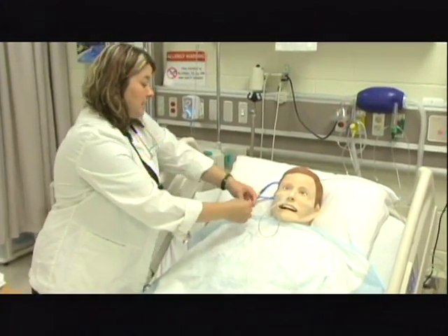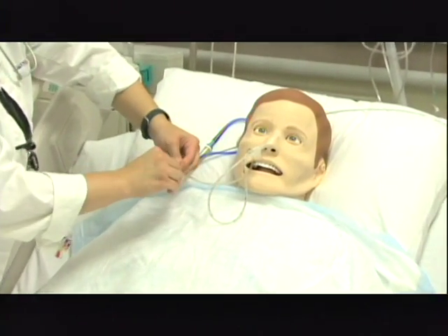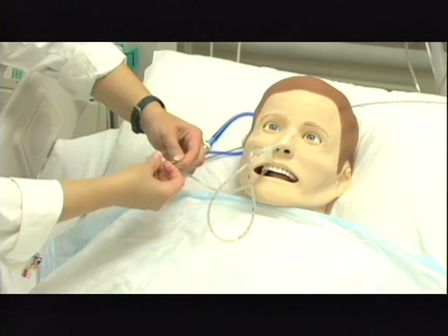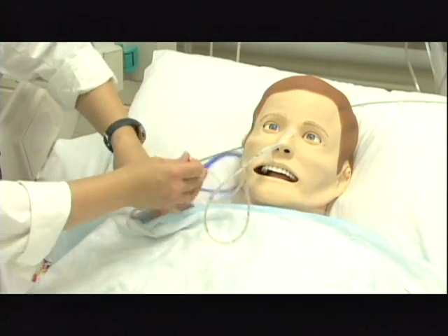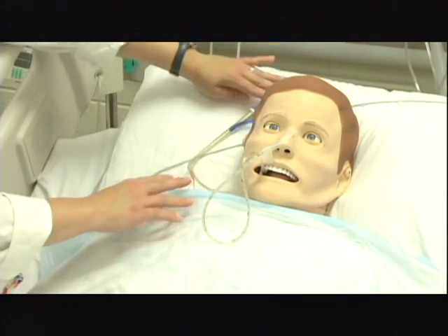There we go. I need to make sure to have him turn his head to the side and make sure that it's not pulling on the tube. Of course, the needle never goes through the tube because it could puncture it and cause leakage. I'm going to attach it up here and make sure that the tube is sitting higher than his stomach level.